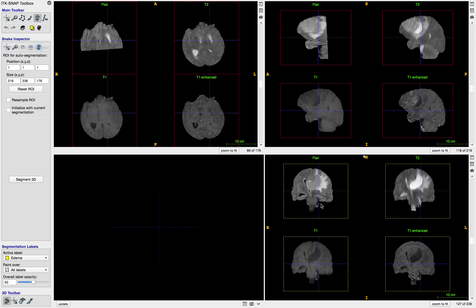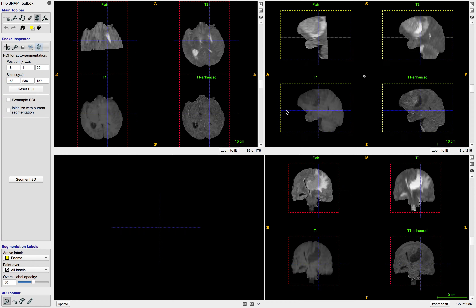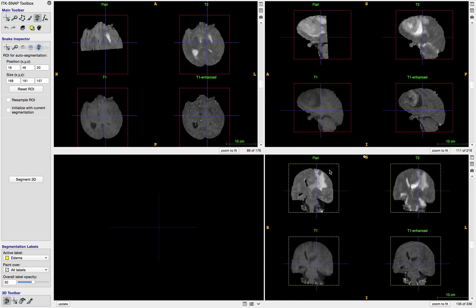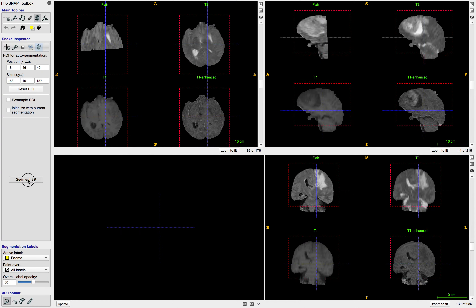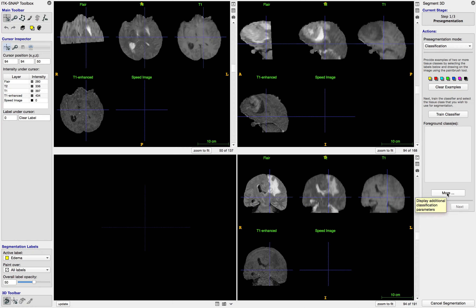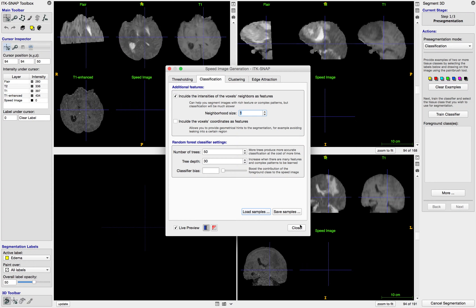Go to the snake tool. I had already looked at this dataset before, so it's been at least partially set up, but I can tighten my bounding box. This is not crucial — it just reduces wasted screen space and memory — but it's not going to make any major difference for the actual tumor segmentation. Once we select the region of interest, click Segment 3D, and just some very quick configuration. We want to go to Classification on the right, then go to More and set the neighborhood size to 1. That seems to be a nice value for getting smooth exterior maps and a little bit more sensitive to texture.